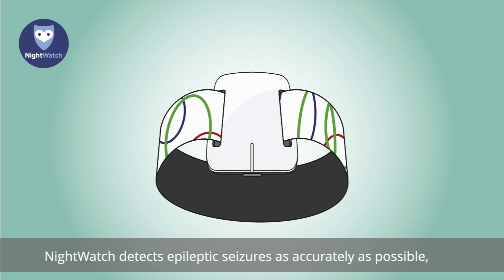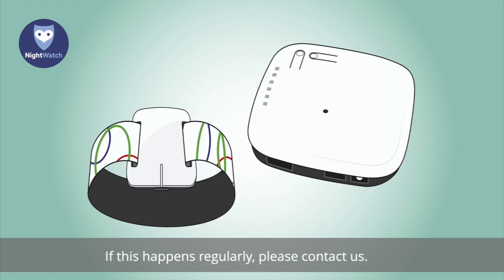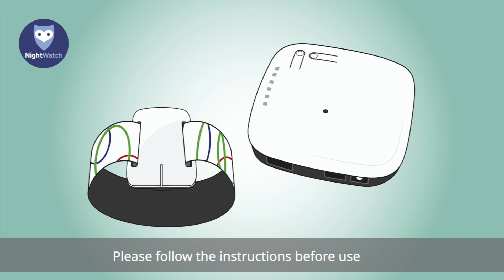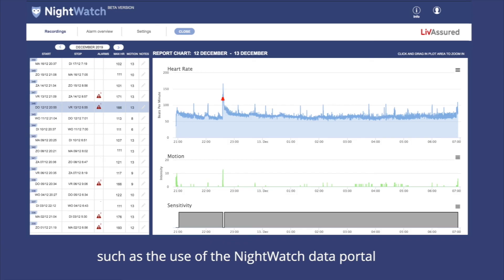Nightwatch detects epileptic seizures as accurately as possible, but it could possibly miss potential seizures. In addition, Nightwatch might sound an alert even when no epileptic seizure is taking place — if this happens regularly, please contact us, as often only a few minor hints and tips are needed to find a resolution. If you have any questions about using Nightwatch, please contact our help desk or visit our website. Our website also offers additional information on other features of Nightwatch, such as the Nightwatch Data Portal, which can be used to view the Nightwatch measurement data.